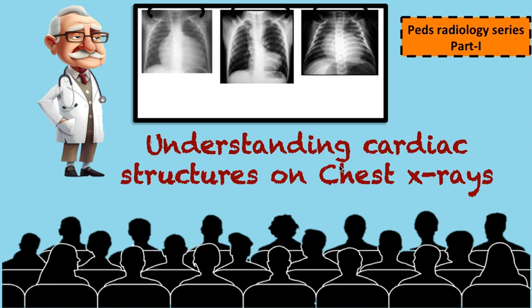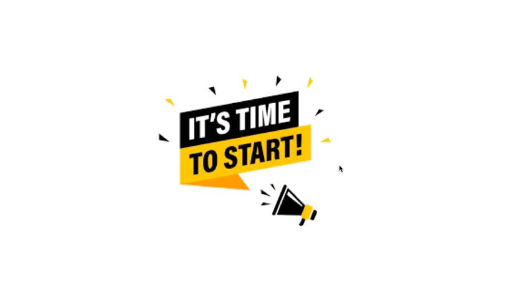where we have discussed mainly chest x-rays, which is essentially the 90% of your whole of the radiology viva. However, extremities x-ray, skull x-rays and abdominal x-rays are also important, and first one must know the important findings and how to recognize them. So let's get started.